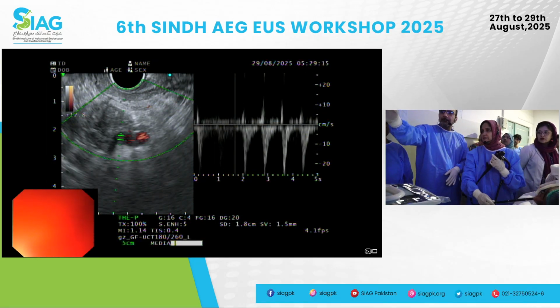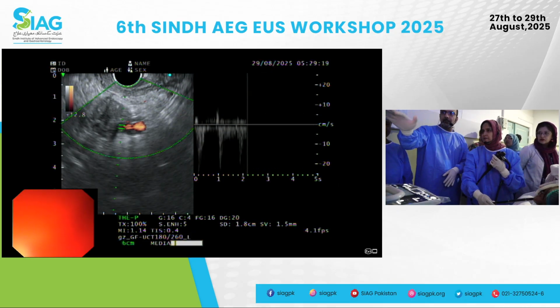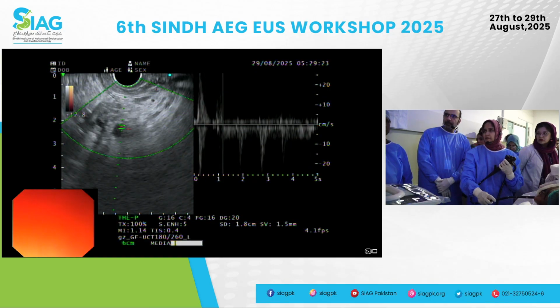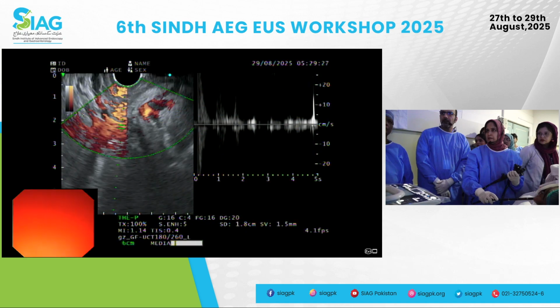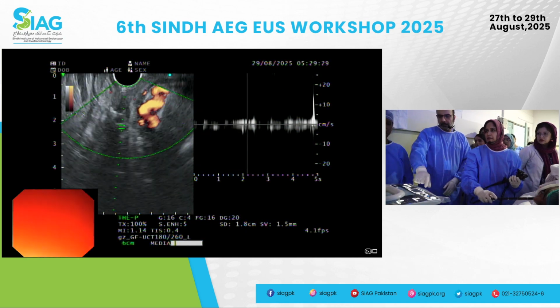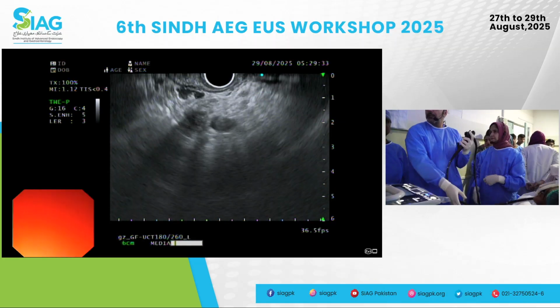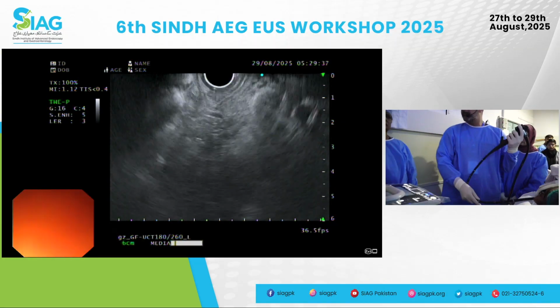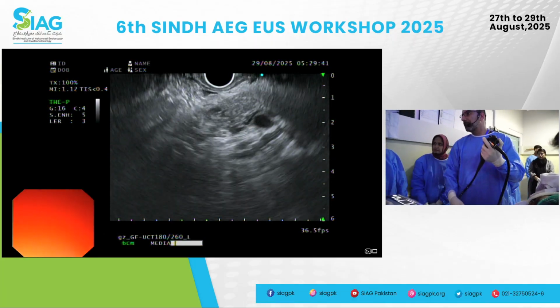Firstly, if you see splenic artery, the next thing is, if that's pancreas, we would expect, go counterclockwise for a second. Keep going counter where you would expect to see your vein. It's all right, you're fine. Let me take over just for a second to demonstrate this. I think your point about the collaterals is valid, but let's see. We have pancreas here. There's our PD.